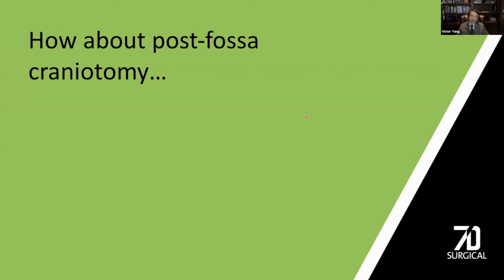So as a result, every time I try to put the perforator or side cutter near the venous sinus in the posterior fossa, we have this automatic sphincter response: what if we are 4 millimeters or more wrong, right?